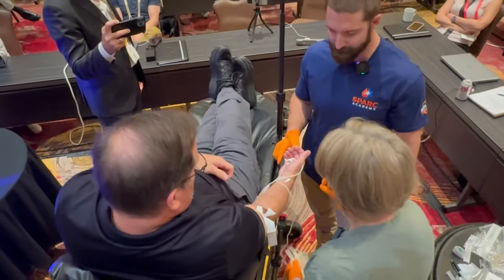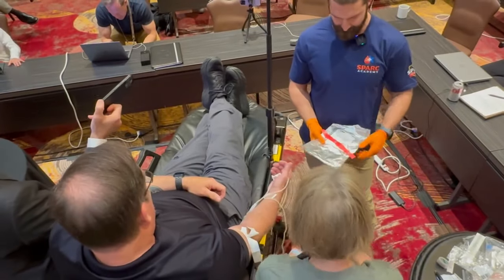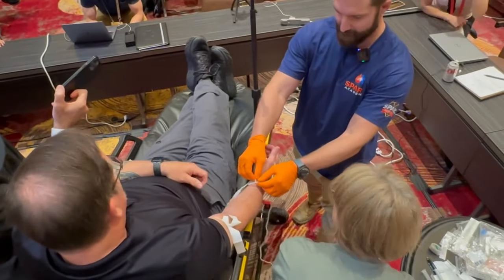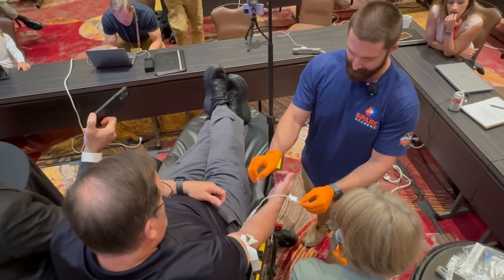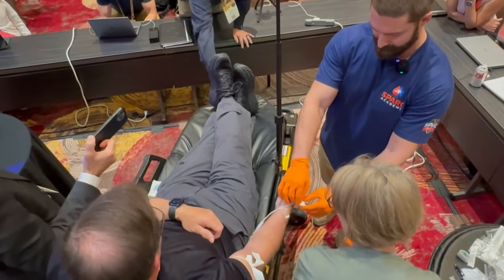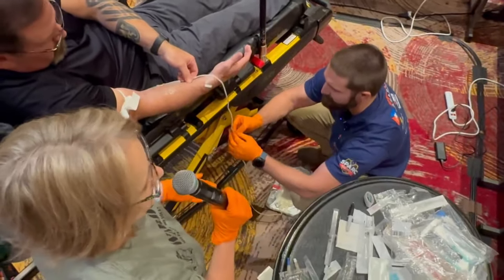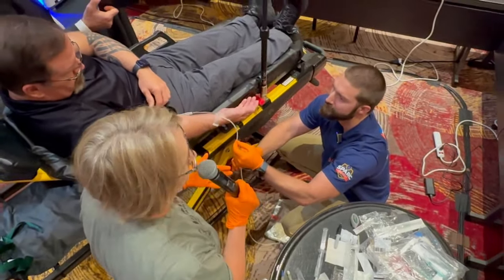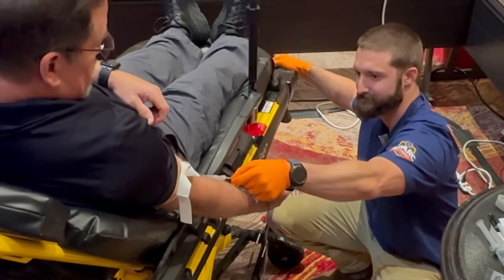We have started the IV line. I took the donor bag to help flow — we've got it secured. It's important to keep the bag low so that gravity is our friend and pulls the blood down into the bag. We'll unclamp and check flow. The bag can stay on the ground — the outside of the bag is not sterile — so if you're in the dirt and you need to drop it in the dirt, that's what you do. Set it for about that 500-gram weight and keep a nice distribution.